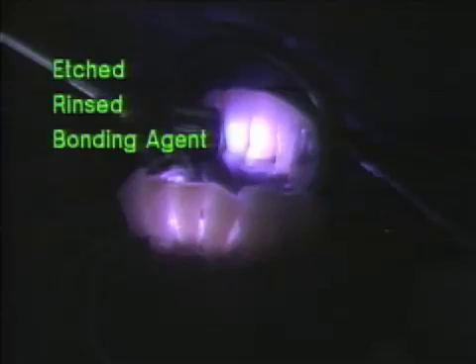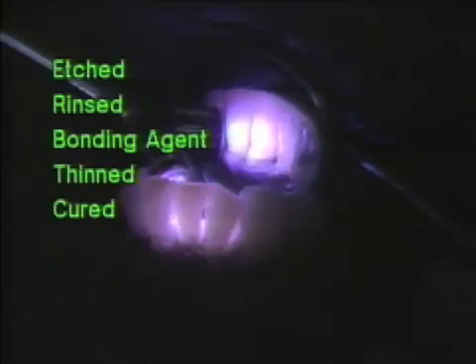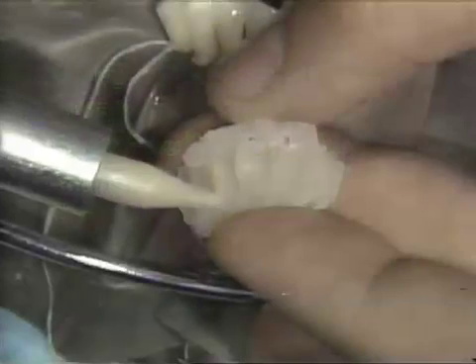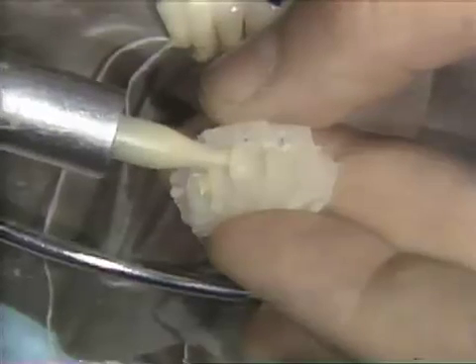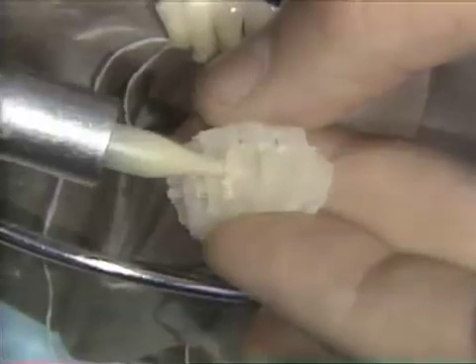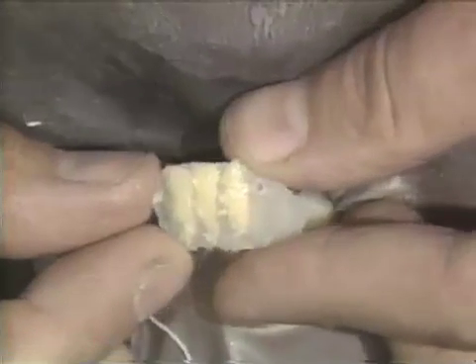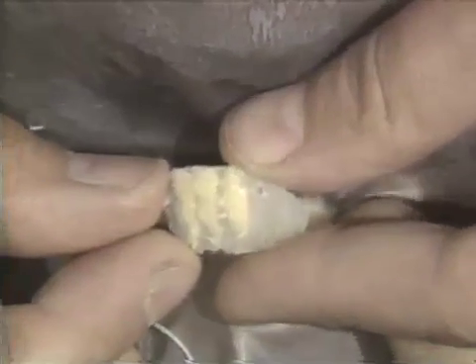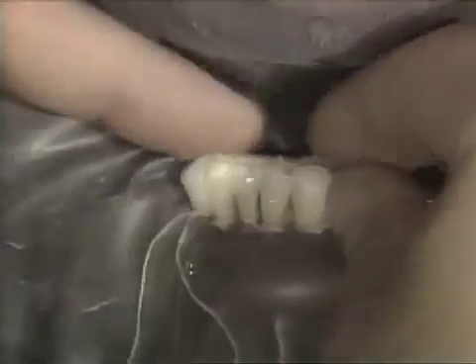As in the Class V, the surfaces will be etched, rinsed, and two layers of dentinal bonding agent placed, thinned with air, and then cured. The light-cured matrix is lightly coated with Vaseline to prevent sticking of composite to the matrix material. The composite material is then placed in the matrix and fully adapted to the linguals of teeth 23, 24, and 25.